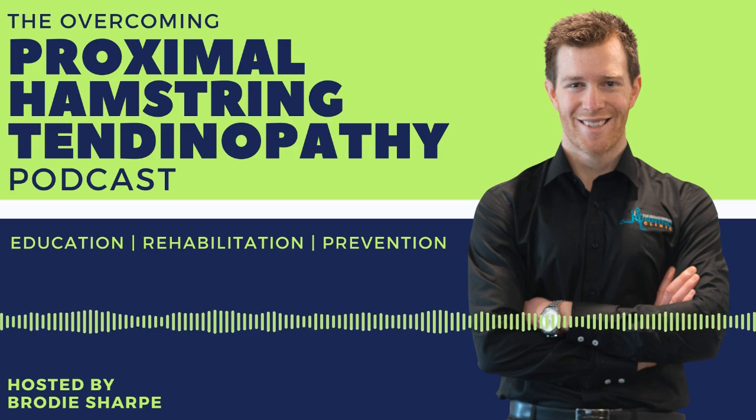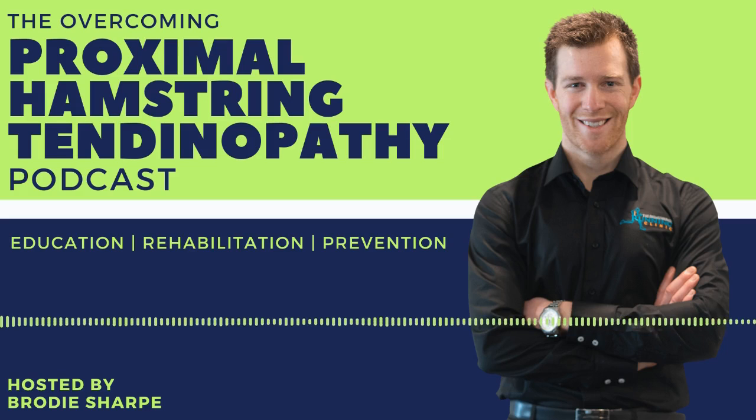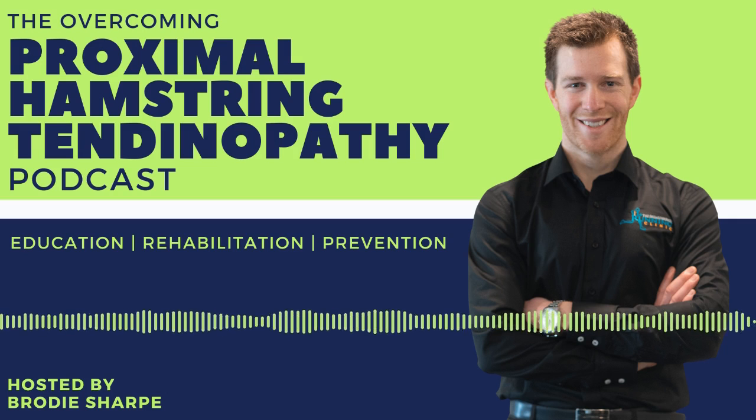See how it goes. See how you respond. If it's quite dormant and not reacting to any stimulus, any rehab that we're giving it, that's when we try shockwave. It's not designed for irritable patients. I know chronic PHT can get extremely irritable. It's probably not the most suitable then, and we need to wait for things to settle down and calm down before we can try some shockwave therapy.